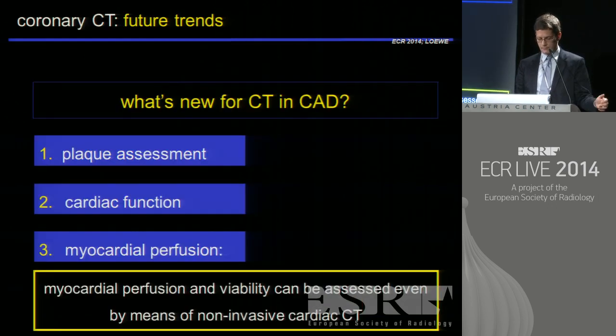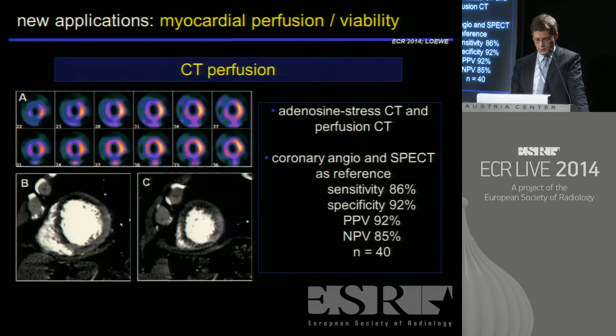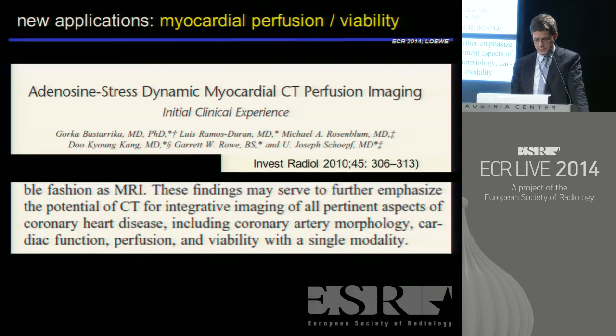And finally, myocardial perfusion becomes possible, as we already heard, even by CT. Myocardial perfusion is still under clinical tests, but I'm pretty sure that within just a few years, myocardial perfusion using CT will become a clinical routine. There are a couple of papers demonstrating perfusion and dual energy, as we have been shown by Marco already, could be a very important and interesting new tool for using cardiac CT as well.